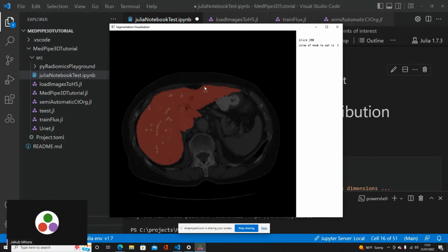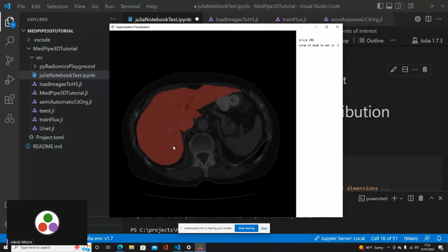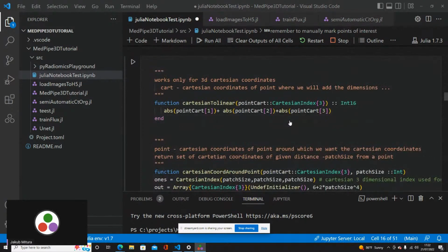Each neighborhood of these points is similar to the neighborhood of each voxel in the liver. So we are collecting the local information of the voxels around any given point, and we will use it for our algorithm to guess where the liver is in the whole image. This is the idea behind it. Very simple idea, very simple algorithm, which will give us some results that we can see and understand.